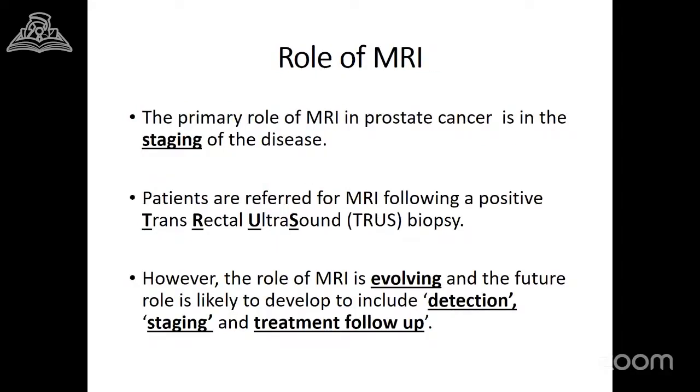So the primary role of MRI in prostate cancer is local staging, especially assessing extracapsular extension and tumor spread beyond the prostate.